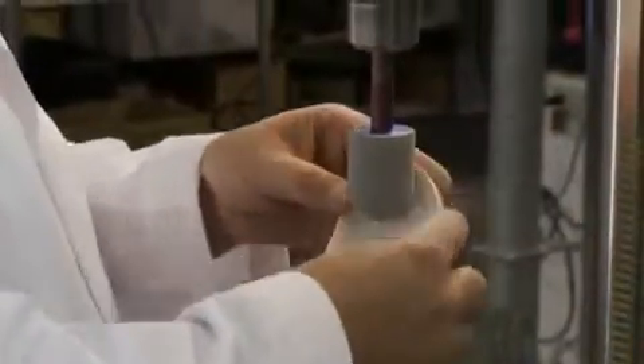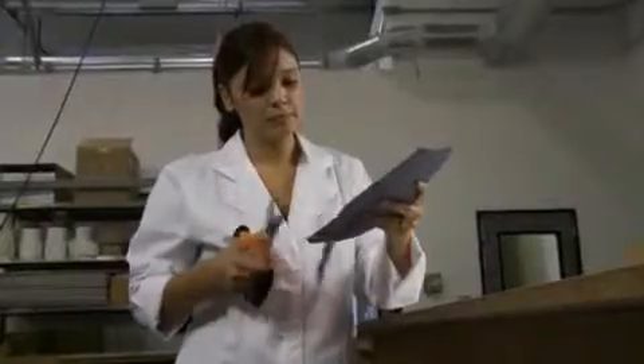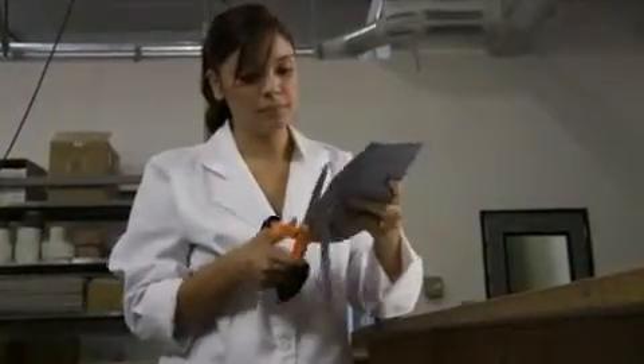Then just finish up with a little light sanding and add a top cover to complete your client's custom foot orthotics. Amfit's CAD-CAM mill gives you complete control over your orthotic fabrication from start to finish.